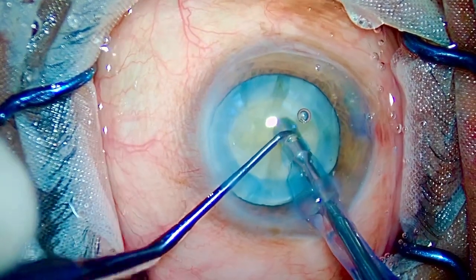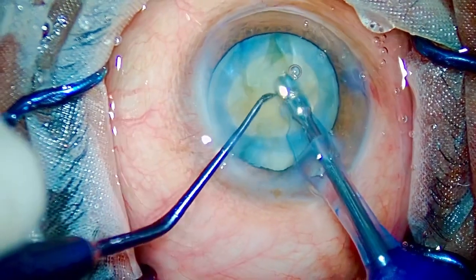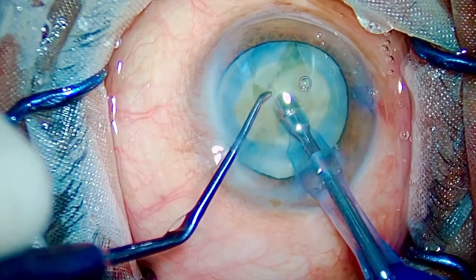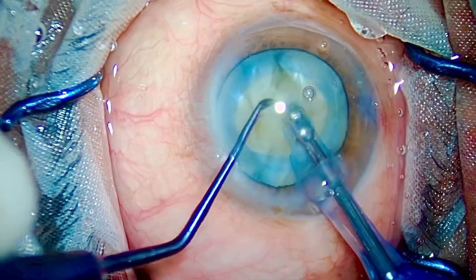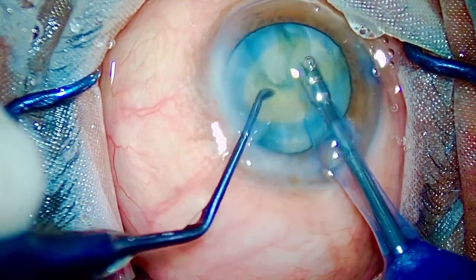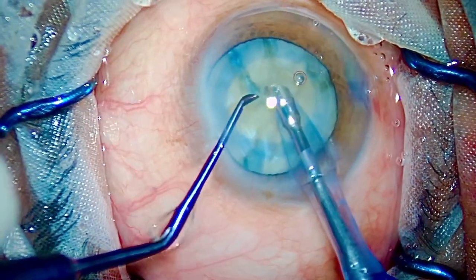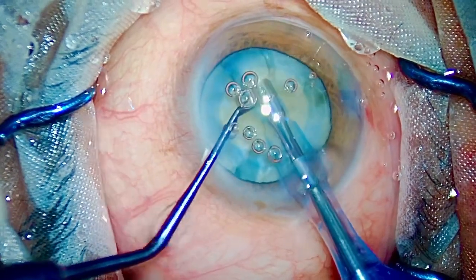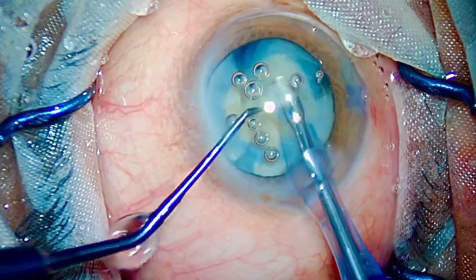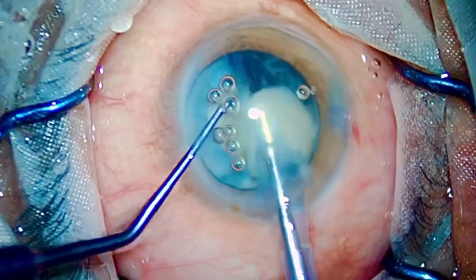As the chopping steps are going on, let me repeat two key steps to remember: never ever hydrodissect cases like these. Start with the FACO directly, aspirate the cortex and start chopping. Keep Rexes forceps on standby and always, always keep the anterior chamber filled with Visco.